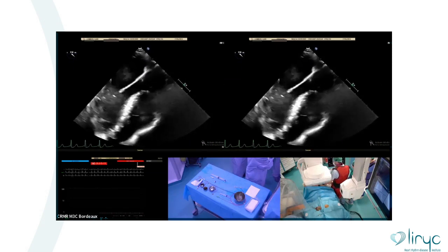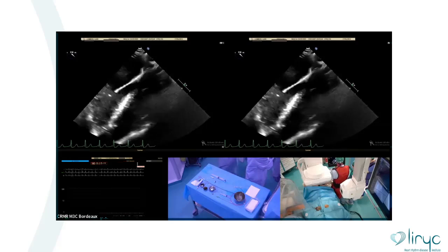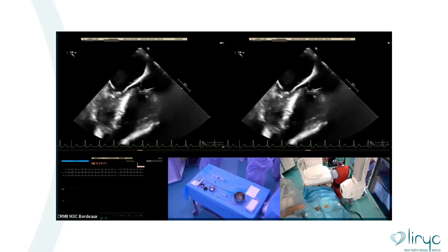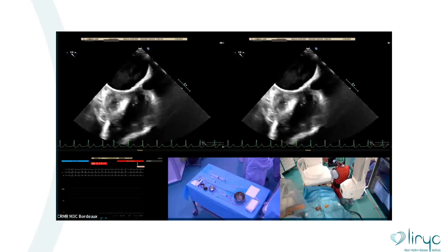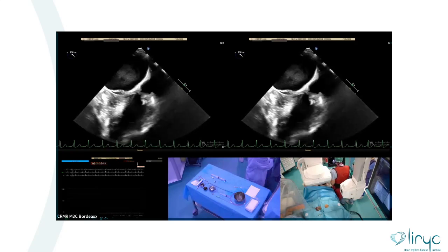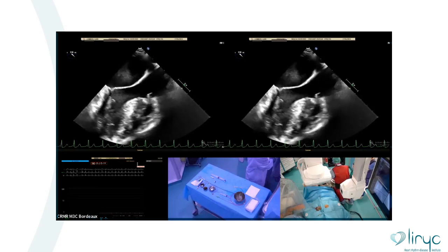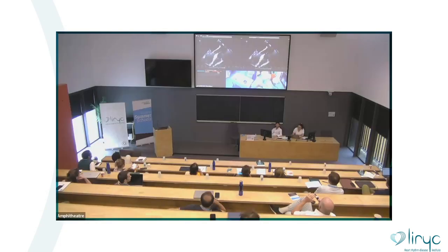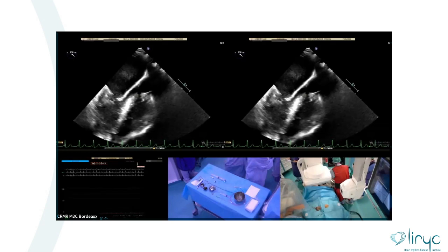It's not a contraindication per se. I mean, even if it's pretty close, you could use different types of devices to close the hole. But it's important to know it because you will not oversize the device and more specifically the left disc, to avoid any contact between the disc and the aortic valve. And so again, here you could see the hole. So this is the left diameter.